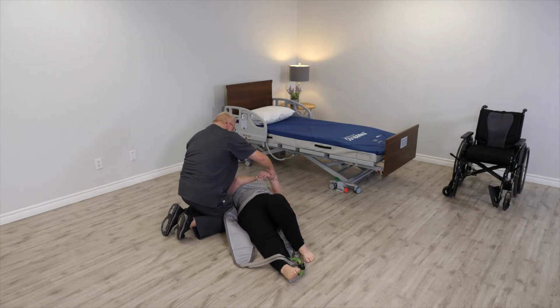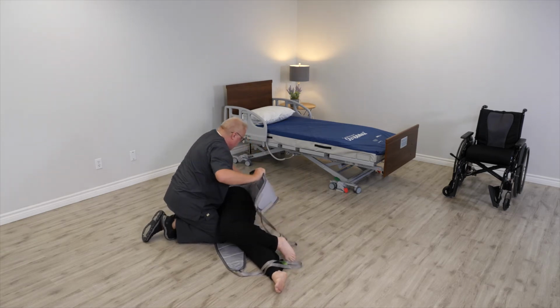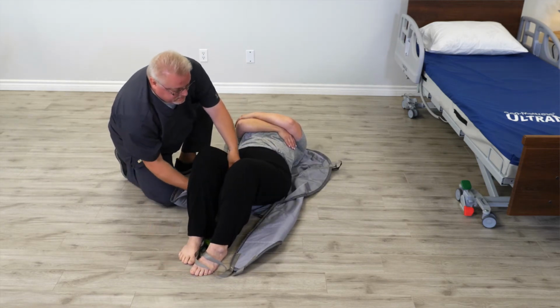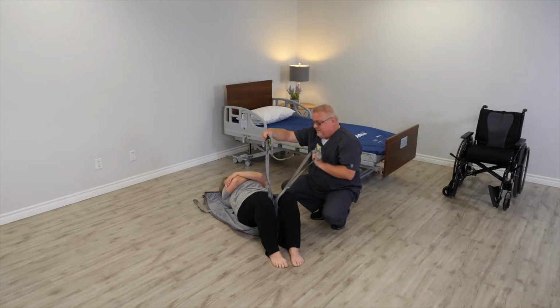Repeat the process on the other side, rolling the patient in the opposite direction and pulling through the material that was underneath the patient. Lay the patient flat again and bend the knees if they aren't already bent. Feed the leg straps under the thighs and bring them up between the legs. Crisscross the straps one through the other, and lay them on the legs.